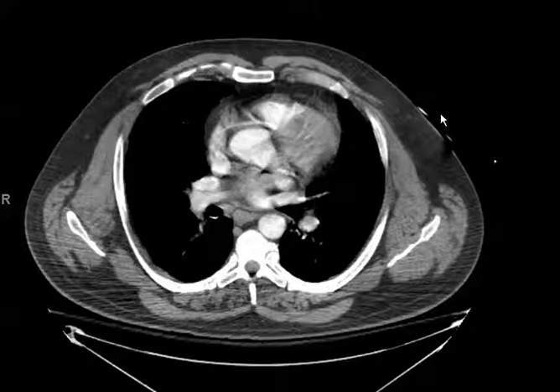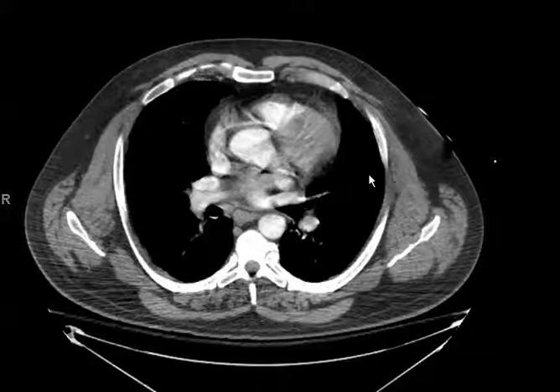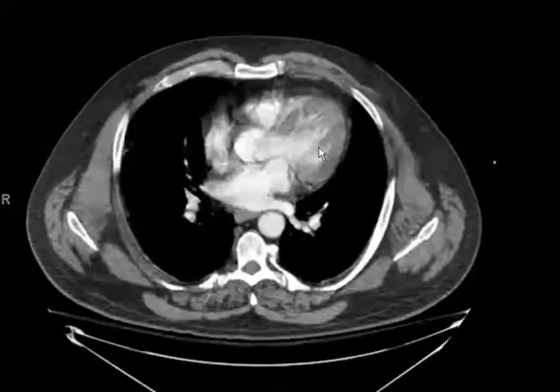This is a 53-year-old male status post-assault — a trauma patient. We have axial CT images through the level of the chest, abdomen, and pelvis after the use of intravenous contrast.